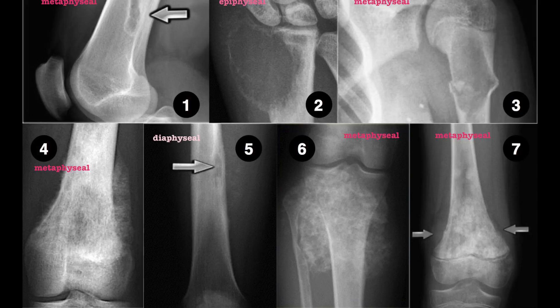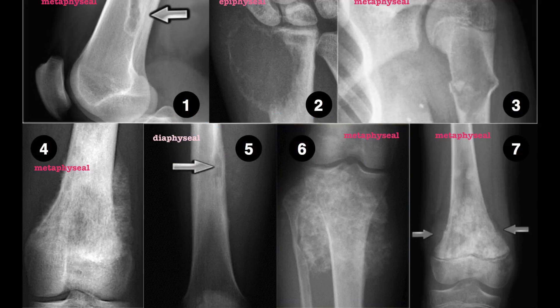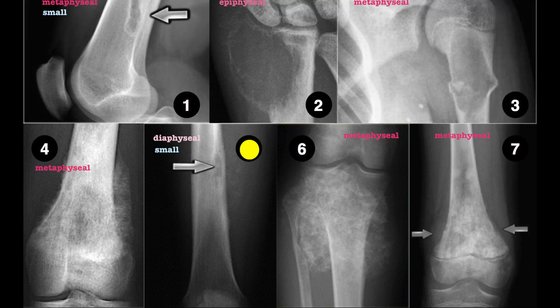The second S is for Size. Large lesions are usually indicative of malignancy. Just by looking at the x-ray we can say that lesions 1 and 5 are relatively small lesions in comparison to lesions 2, 3, 4, 6 and 7, which we can say are relatively large lesions.